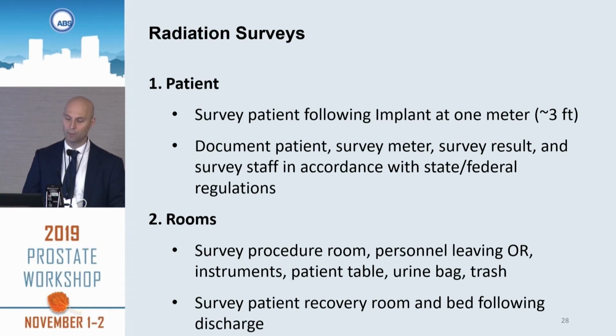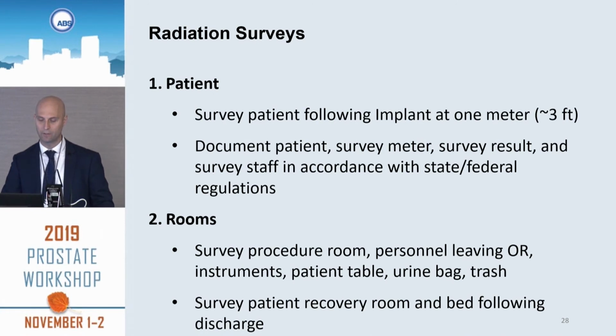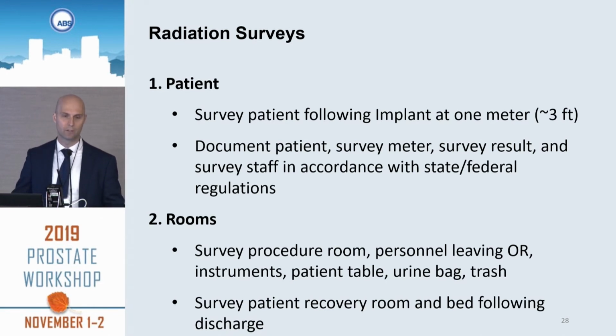Radiation surveys are required by law to release the patient after implant, and the release criteria can be found in the NRC regulations. Additionally, it's best practice to survey the room afterwards. So the first part is to survey your patient and document it. The next part is to survey the room. You might think it's sufficient to do a source inventory, and you always should do your source inventory.